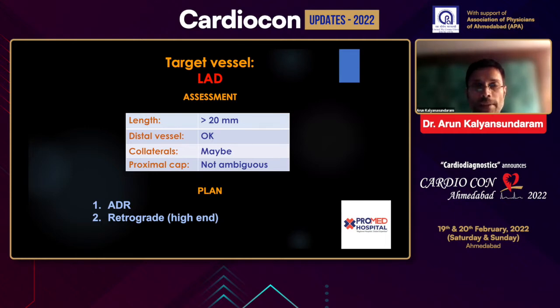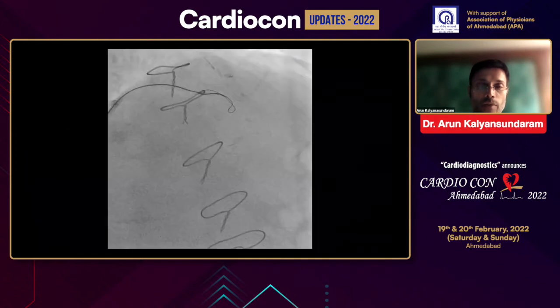So this is what goes into avoiding complications. Number one, go into the plan, understand the anatomy, and go with the safest approach first. If that doesn't work, if you're really comfortable, then and only then should you consider retrograde.